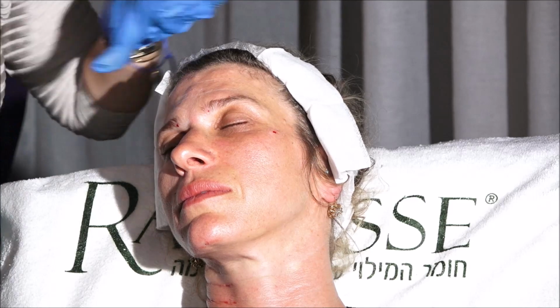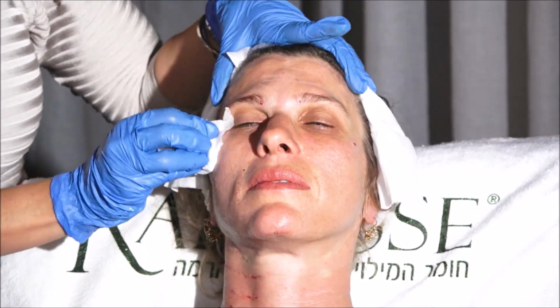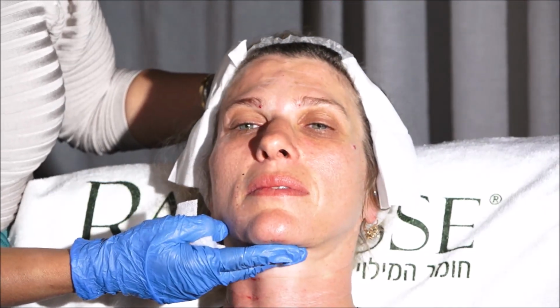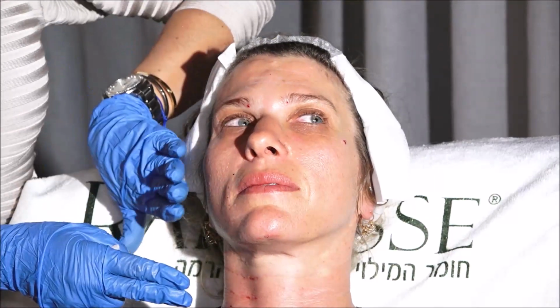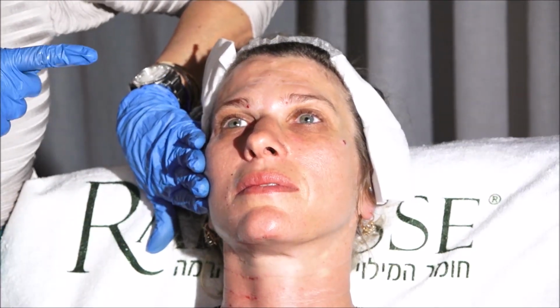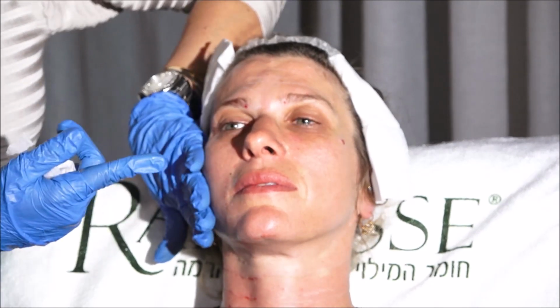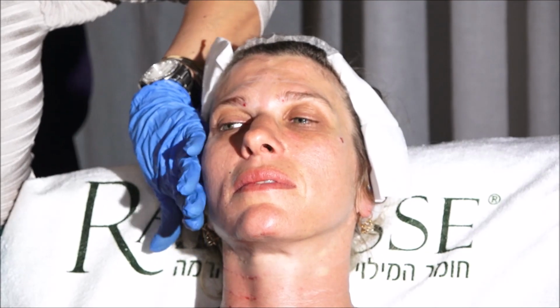So this is how I did changes in my toxin injection. This is how I mark. You saw me injecting the toxin, and this is how I normally treat patients like her. I advise her that she will need another session, as I showed, most probably 2 or 3 sessions even, of 1 syringe, half each side, in a month, normally I do, for the Radiesse dilute.